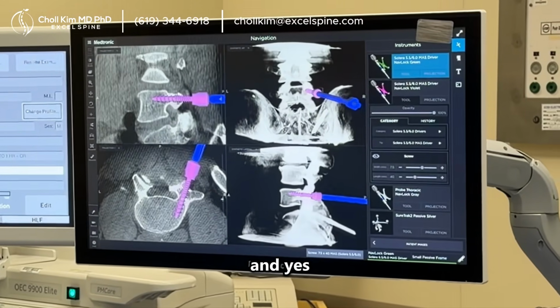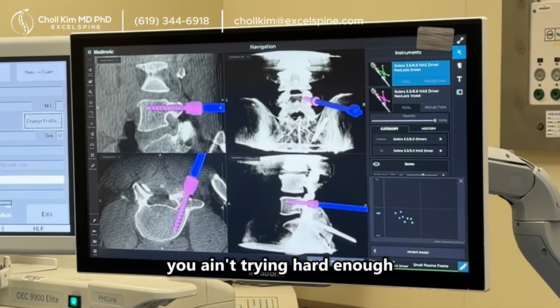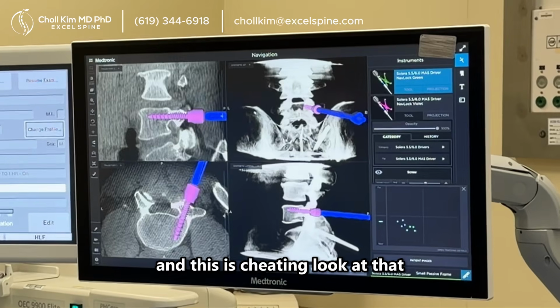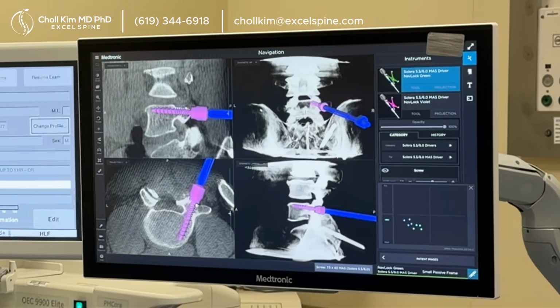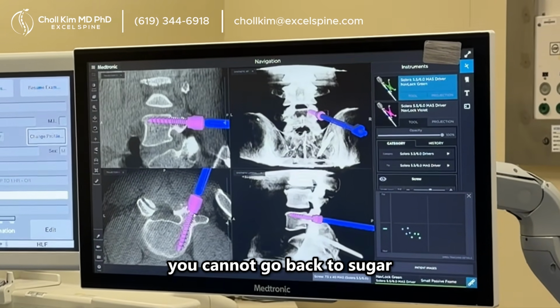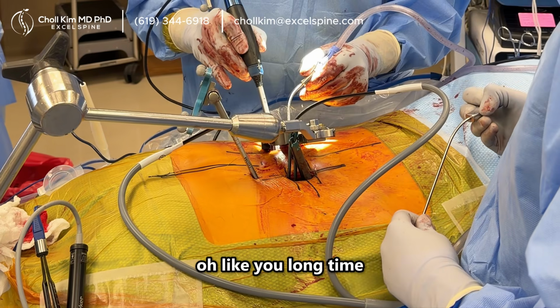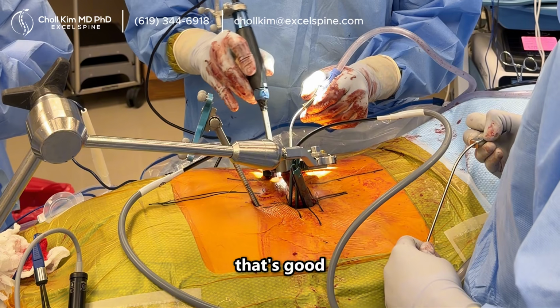And yes, like my mom always said, if you don't cheat every once in a while, you ain't trying hard enough. And this is cheating. Look at that. I don't even know how I put in pedicle screws without navigation back in the day. It's sort of like once you taste honey, you cannot go back to sugar. Oh, likey, long time. That's good.